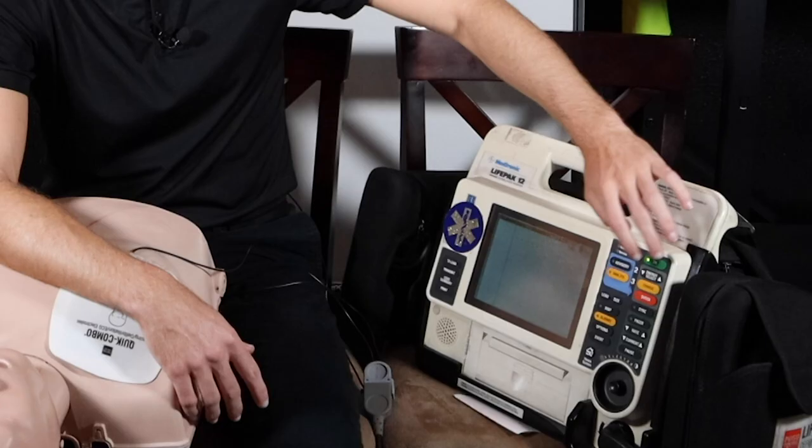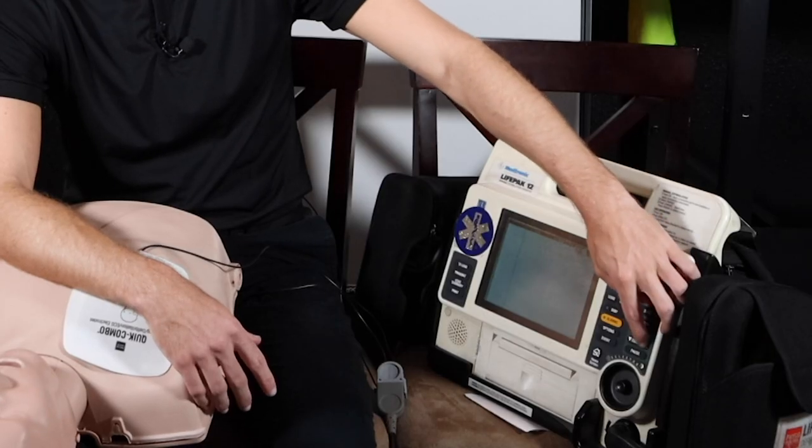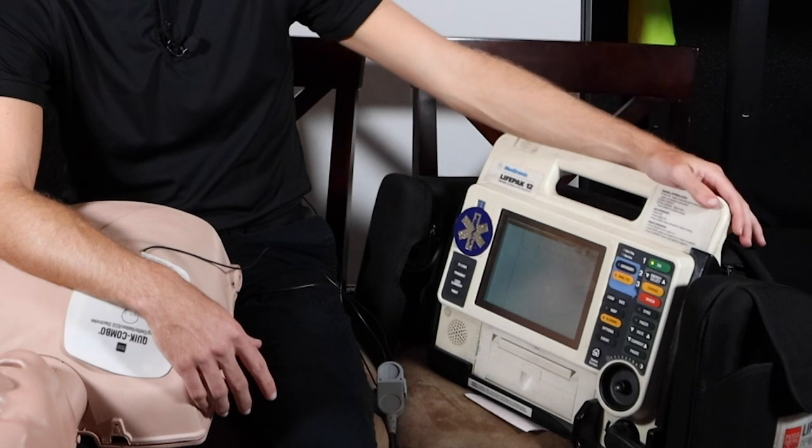Now down below here we have the sync button for a synchronized cardioversion. So before we do synchronized cardioversion, we need to hit this button — hit sync — to sync up for synchronized cardioversion. Then we would charge, then we would shock. With defibrillation, all we need to do is select the energy, hit charge, and then go ahead and shock the patient. Now with the pacer, which is down here, we hit pacer, and then what we do is we go ahead and choose the rate, and then actually go ahead and choose the current, and then go ahead and pace the patient.